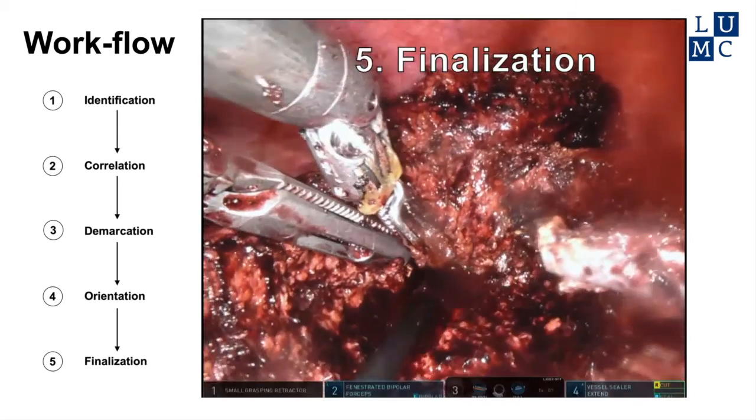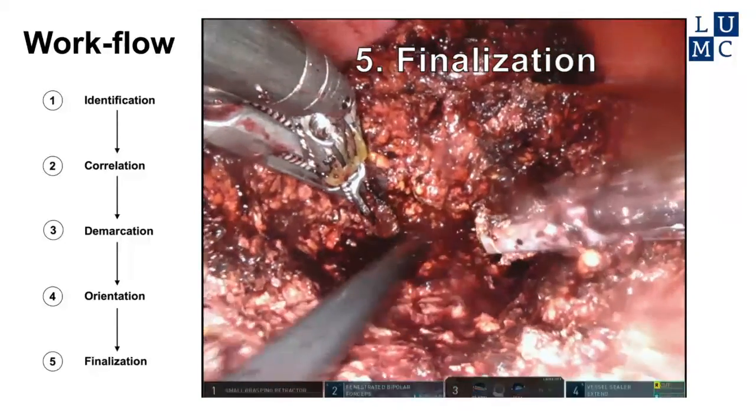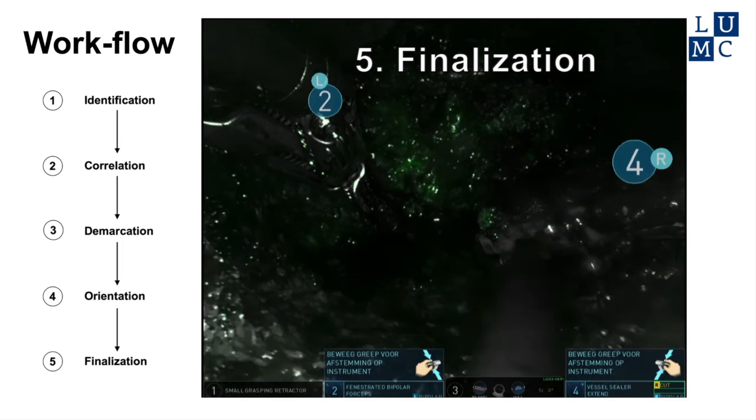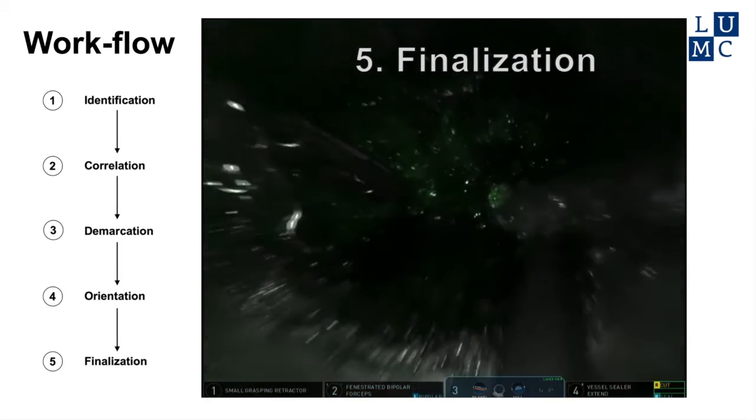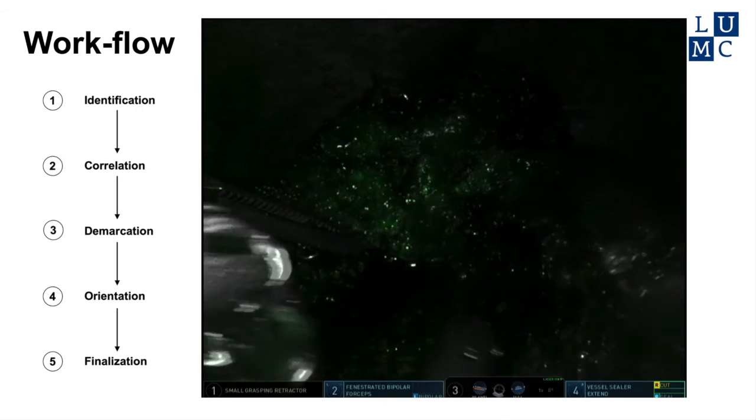After finalizing the resection, the wound bed and specimen are both inspected for fluorescent signal. In this stage, it is important to maintain an overview of the wound bed and the specimen. No protruding rim or residual rim is found in this case.